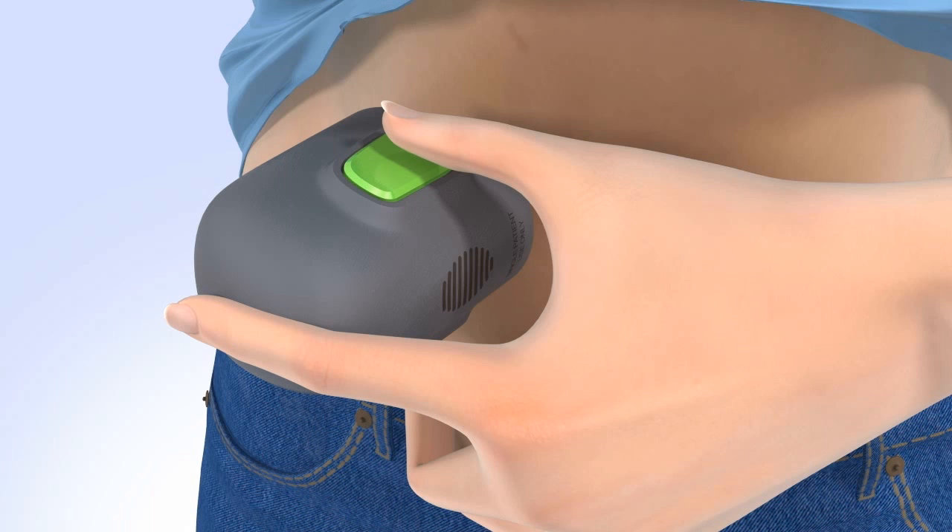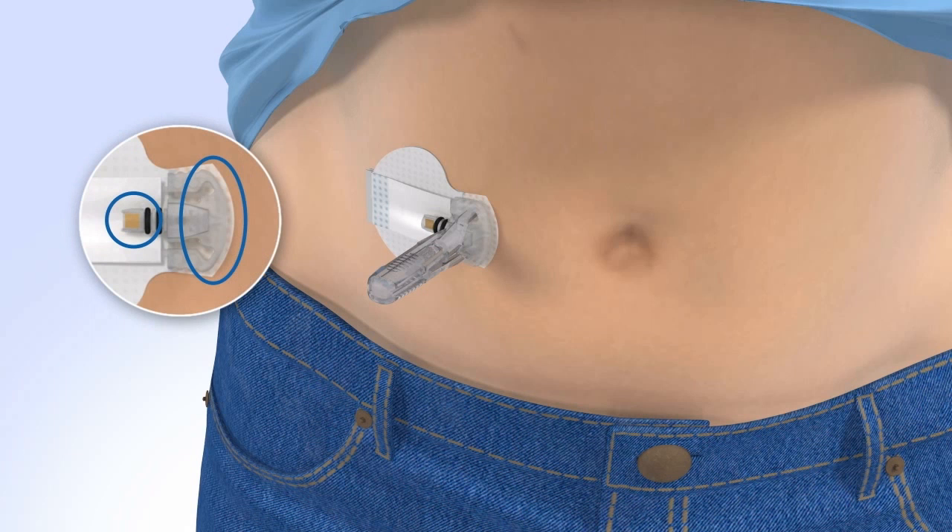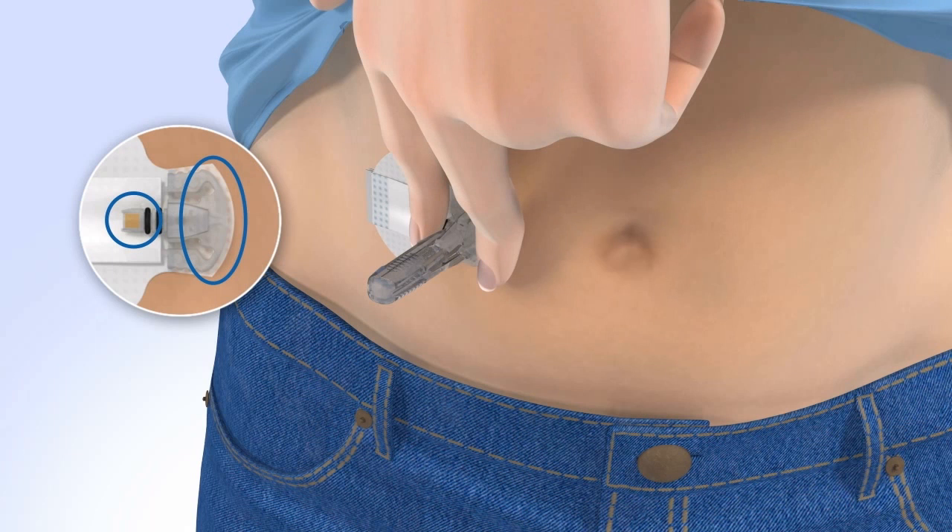Do not pull the surter away from your skin yet. Continue to hold the surter against your skin to allow time for the adhesive to stick. Then, slowly pull the surter away from your skin, making sure you do not press the buttons while doing so. With one hand, gently hold the sensor by placing one finger on the front of the sensor and one finger on the sensor connector to ensure your glucose sensor stays in place.